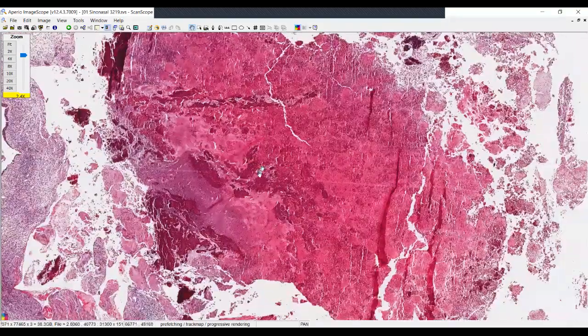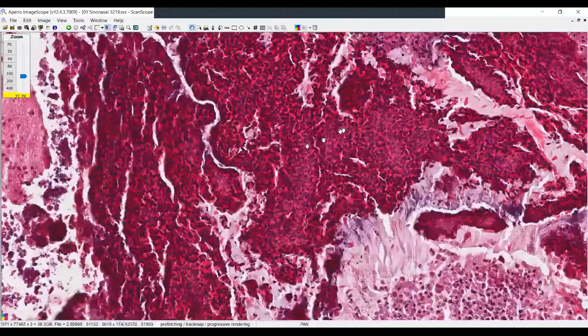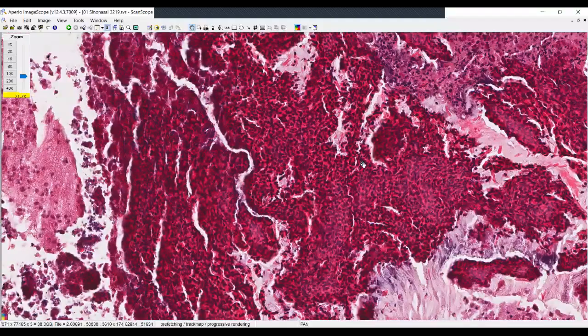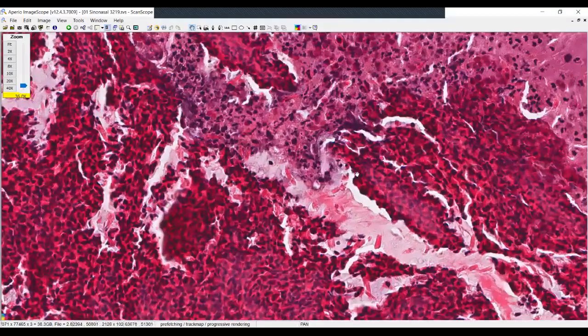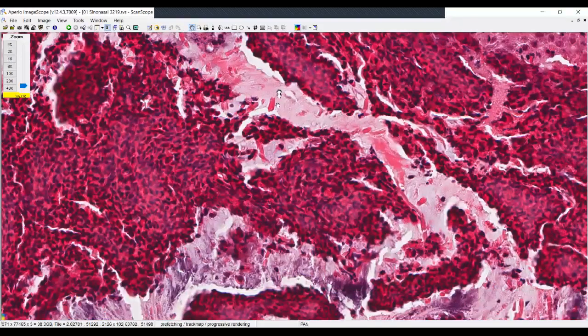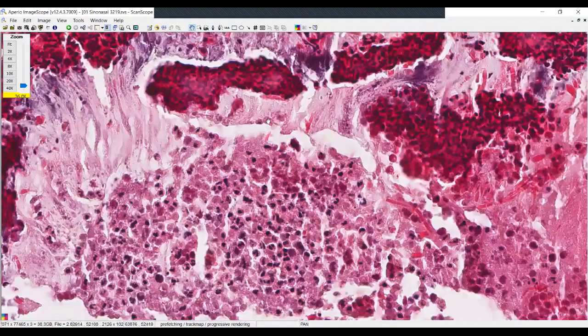And then finally, let's go over to this area here, which was much more eosinophilic. And as I look at this, I think all of you can tell that this is a remarkable alternating tide line appearance, showing numerous eosinophils that have degenerated. And in fact, if you go to high power, you can see that they are very well-developed Charcot-Leyden crystals as a degenerative phenomenon from the eosinophilic degeneration.